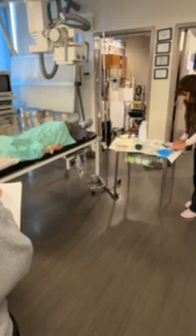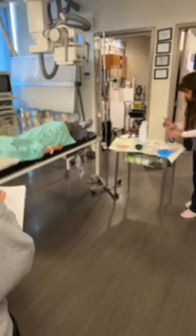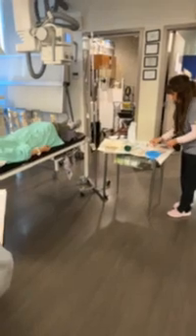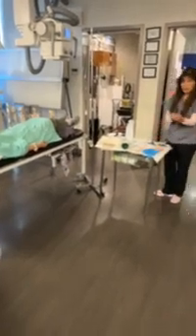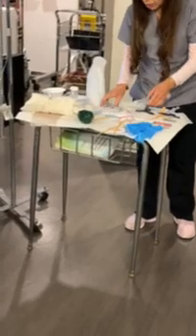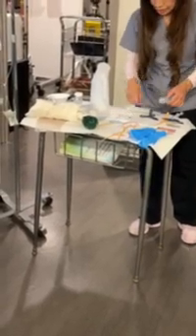Thank you for the gloves, I forgot about that. My marker's ready. So here, I will have the injection already with the contrast withdrawn, okay? Everything ready to go, Band-Aid, and so on.